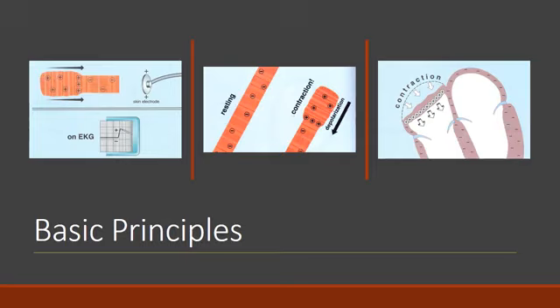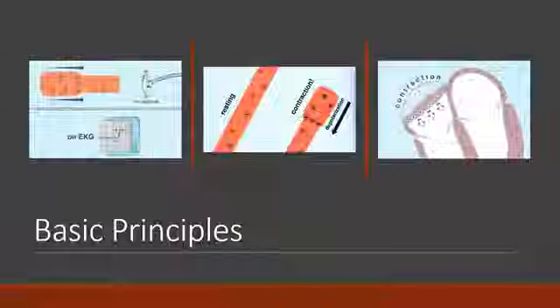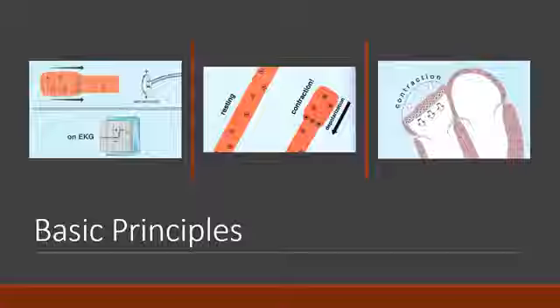And we can see in the picture that this will physically push the blood from one chamber of the heart to the other. Now, as this relates to the EKG, there's going to be a positive and a negative electrode that will measure the electrical current. As that positive charge moves towards the positive electrode, that will cause an uptick or a vertical rise in the EKG tracing. And if that electrical positive wave were to move away from the positive lead, then we would see a downtick or a drop in the EKG tracing.